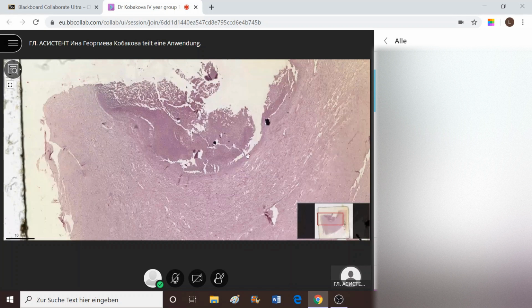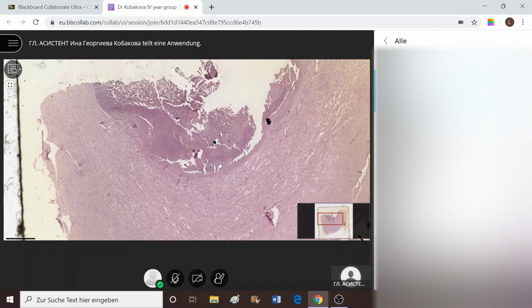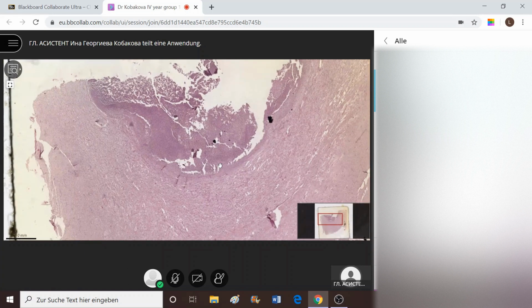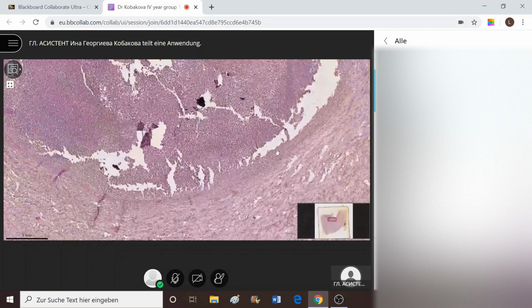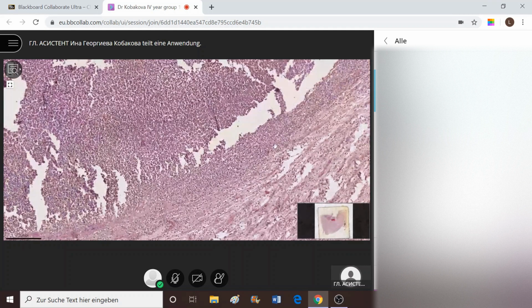We don't have fibrocytes inside. This is sort of a membrane which is mostly demarcated by foamy cells and neutrophilic leukocytes, which are actually producing pus, which goes inside the cavity of the abscess. And that is why it's called pyogenic, because it's producing pus.